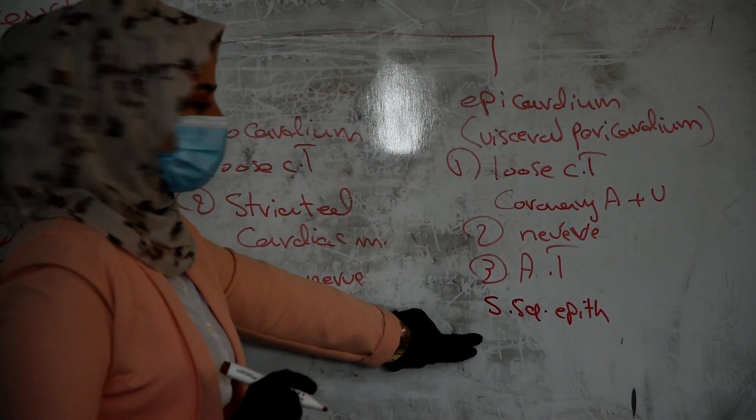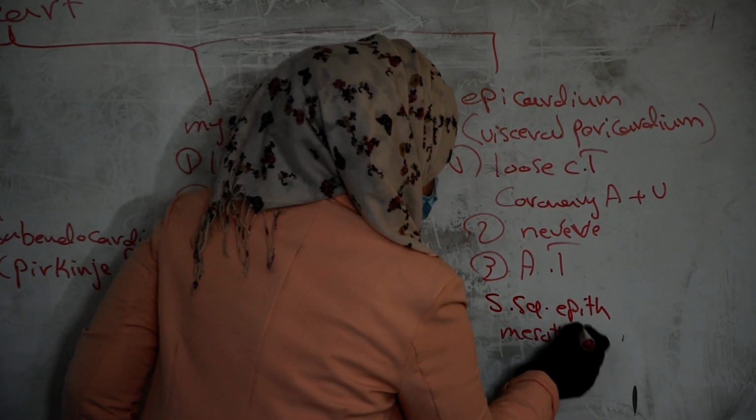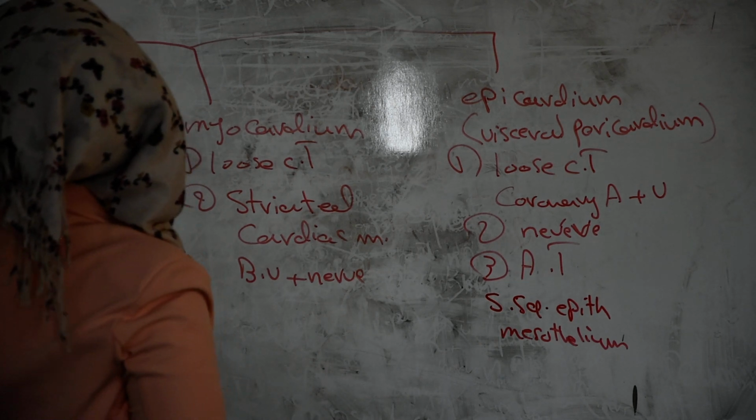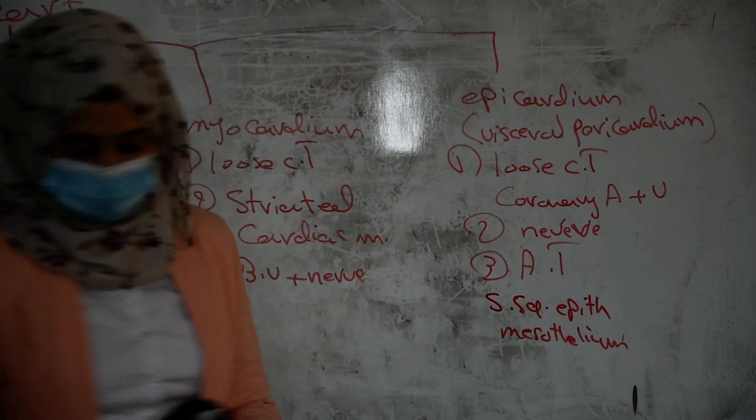At the outside it's called mesothelium. So from inside it's endothelium and from outside is mesothelium. Okay. I'll change this slide to another slide.